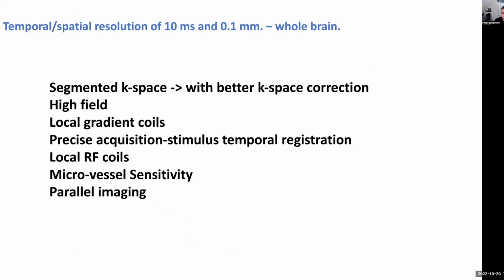So, really nice work at MGH by Kawin Setsompop and his graduate student looking at EPTI, which is a way of chopping up K-space in arbitrary ways to get at either extremely high resolution or other information.